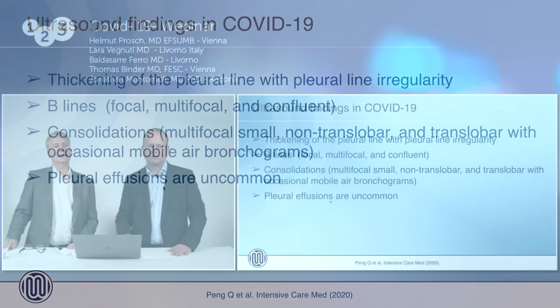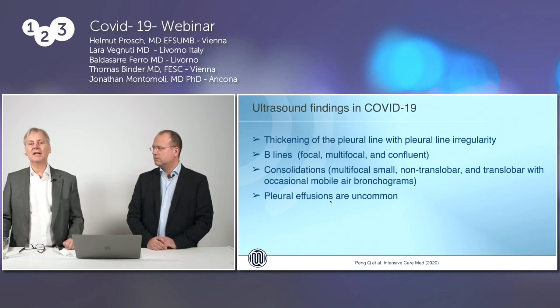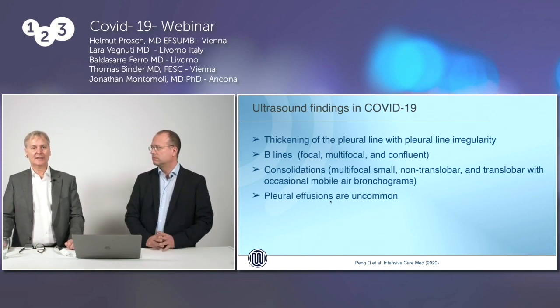Yeah, thank you, Helmut. I think this is a very important lecture because I think lung ultrasound is definitely underutilized. It's such an easy and very good examination technique, especially considering that you have these small handheld devices. You can go into the intensive care unit. This is always a big advantage, especially in the situation where you have infections, where you don't want to bring in a big machine. Maybe Lara, Baldo, what is your experience here?